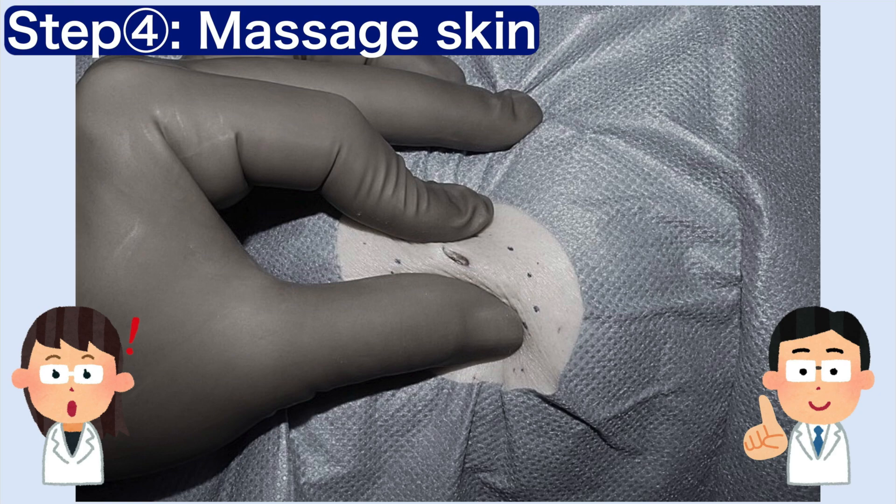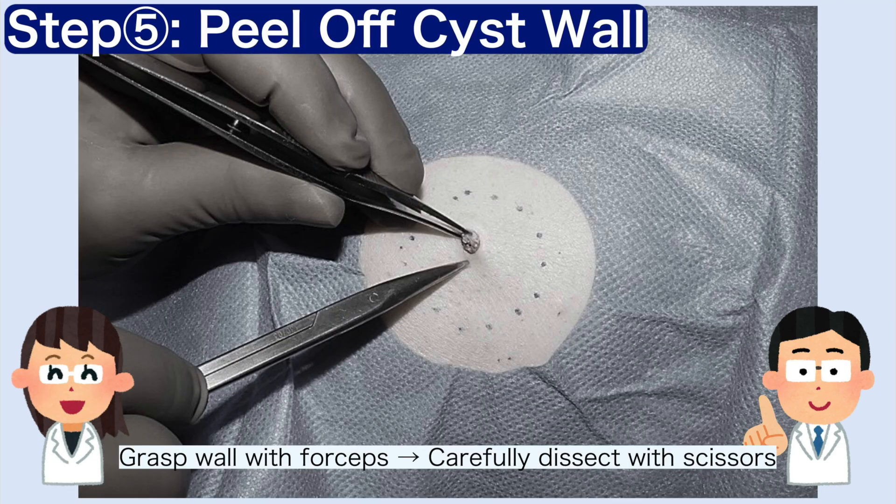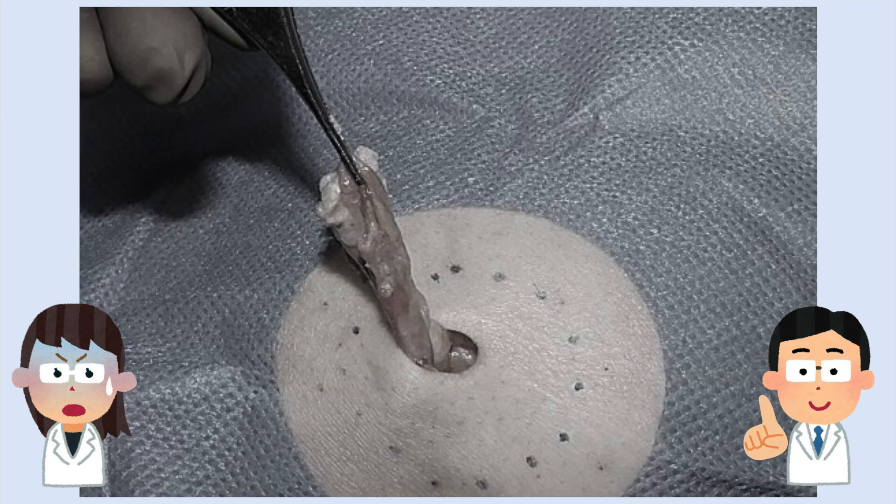Step 4. Massage the skin to detach the cyst wall. Step 5. Then grasp the edge with forceps and carefully dissect it with scissors until the collapsed cyst wall is removed. The collapsed cyst wall is pulled out through the small opening like a deflated balloon.